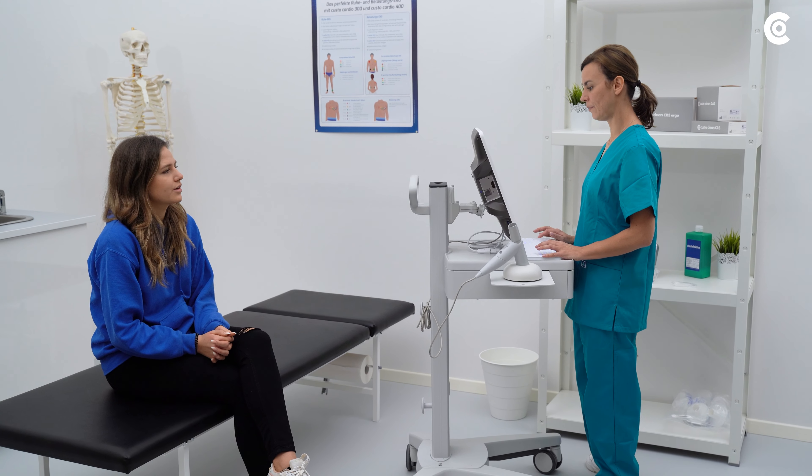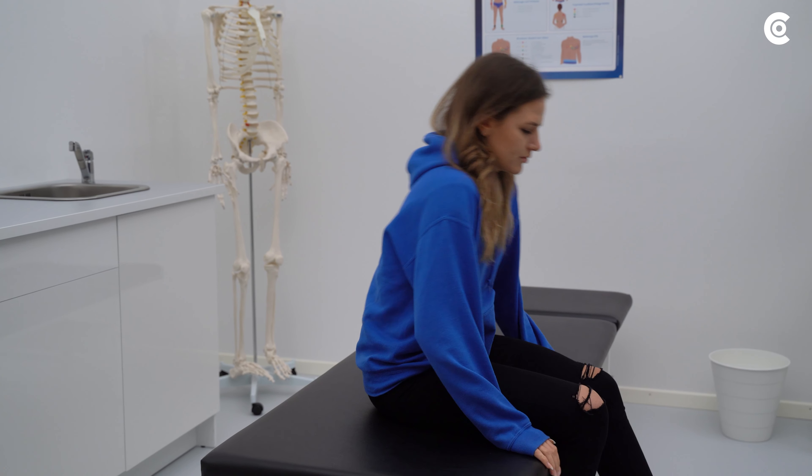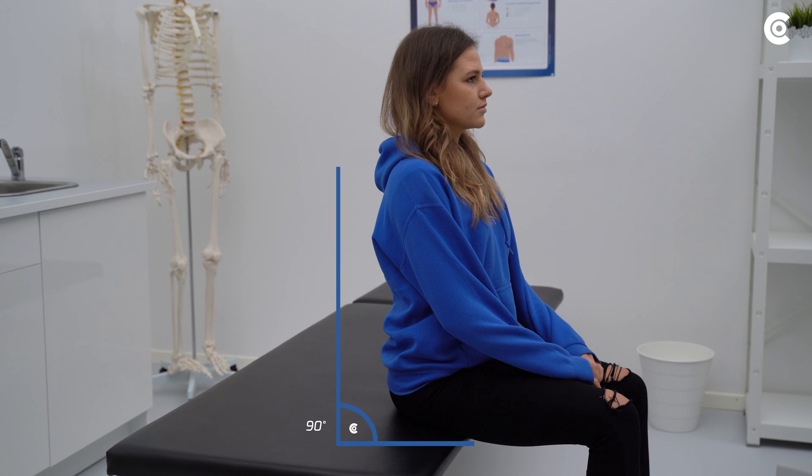After answering the questions the medical personnel has asked you, please sit upright. Make sure that your back is straight.